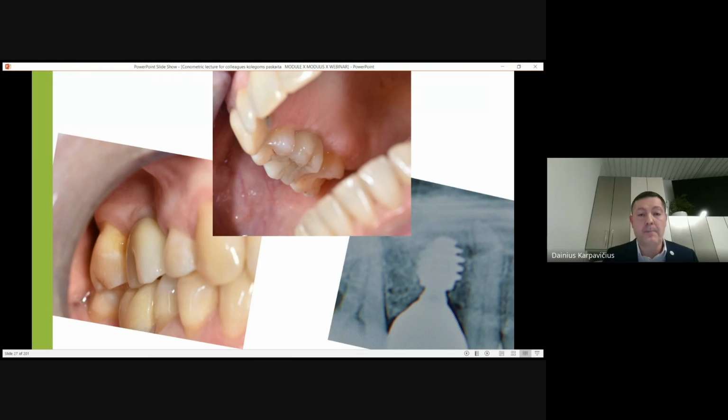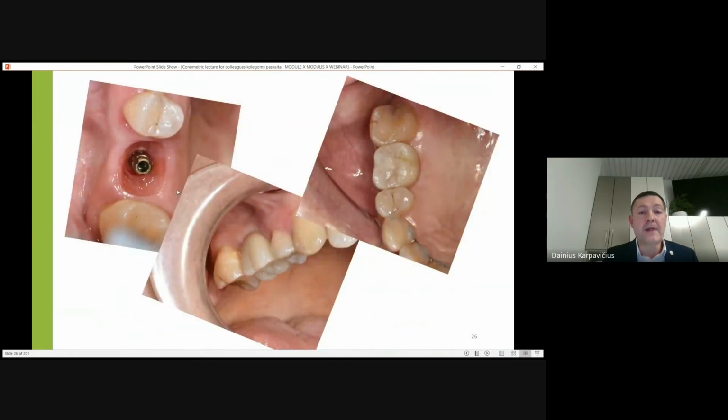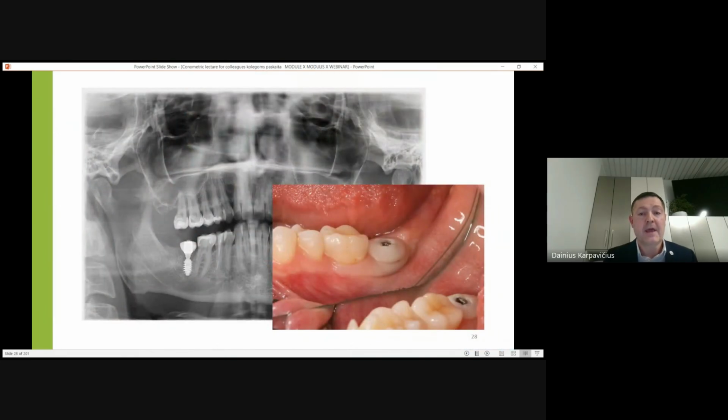Take a look at how a space looked a bit previously, then putting the implant, putting the prosthetic, and after about 2 years, what nice conditions we have around this implant. Quite often when my colleagues are talking about soft tissues and prosthetics, take note that quite often we are talking about the upper jaw. But the upper jaw is quite easy with soft tissues because we have the palatal close to it, if it is considered a tuber, and managing this gingiva is easier.